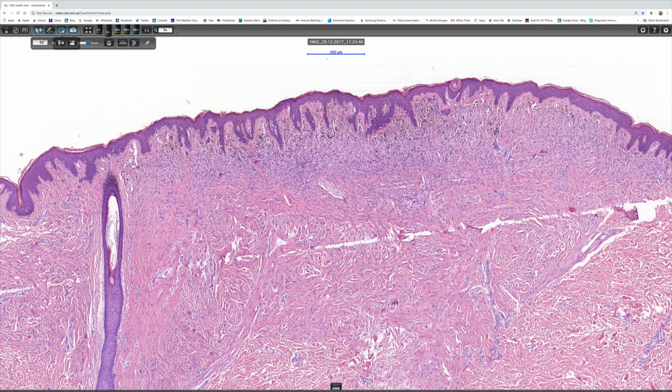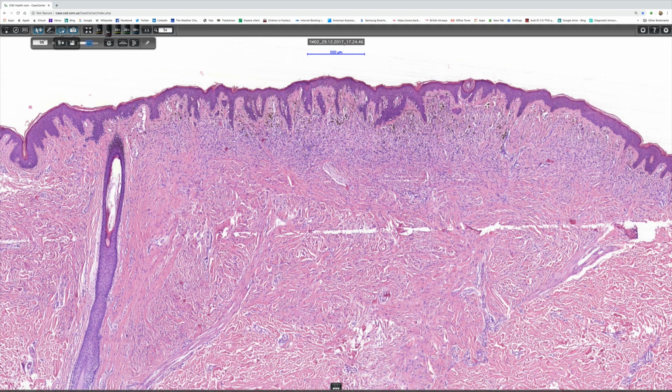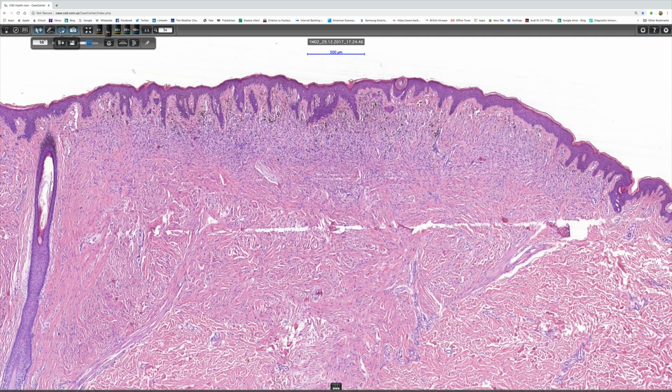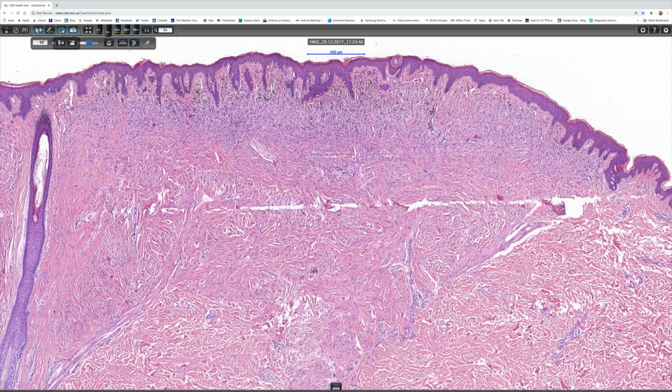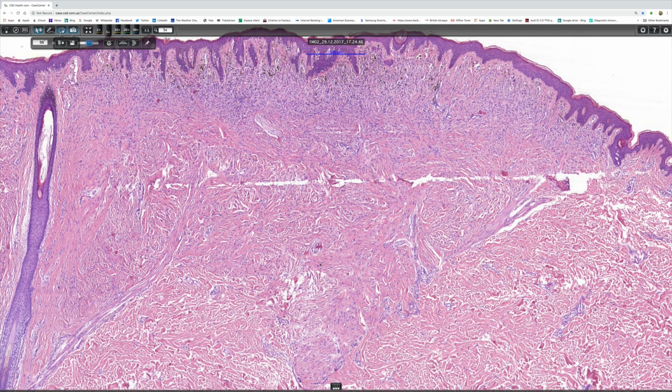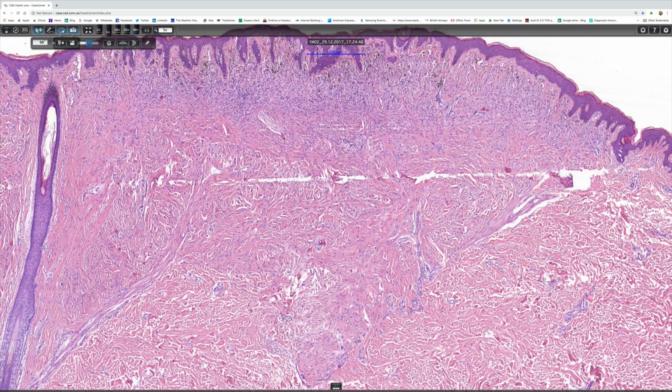And see what we can make out in this lesion. Well, it's showing lentiginous hyperplasia, I suppose, of the epidermis, and there are certainly increased numbers of melanocytes, but I'm not sure whether there are any junctional nests or not. But then we look in the superficial dermis, and there's lots and lots of pigment-laden macrophages or melanophages, and then there's this infiltrate, and as we go deeper, there's tremendous desmoplastic stroma and very small nuclei scattered around.